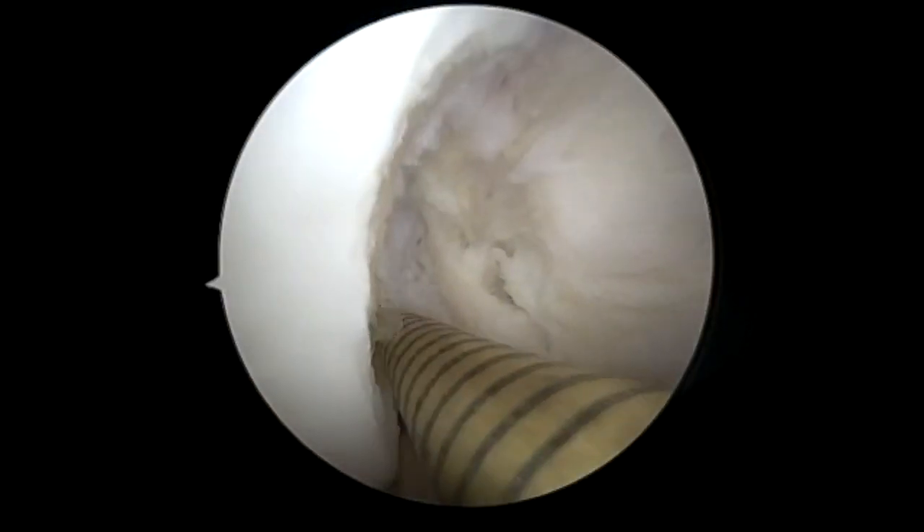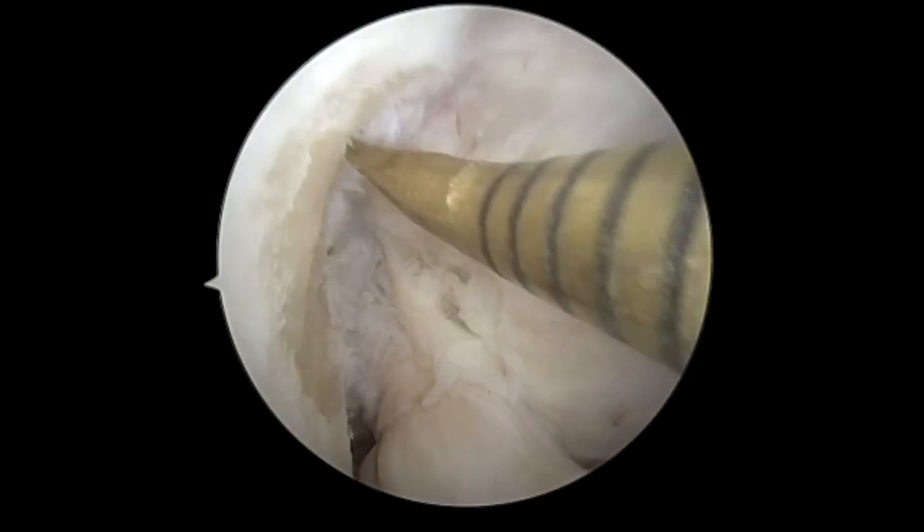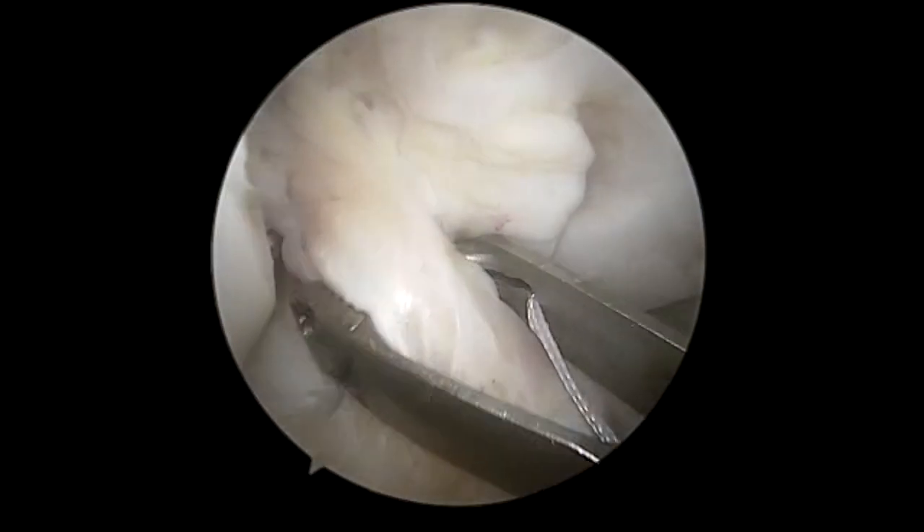Then we're going to microfracture the notch. We do one microfracture hole in the area where we want the trajectory to go.